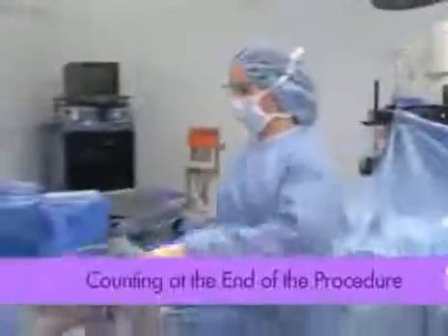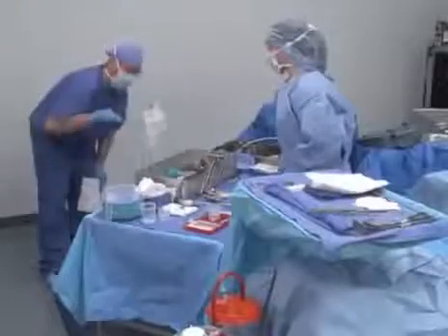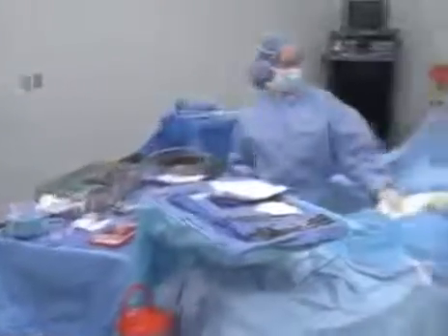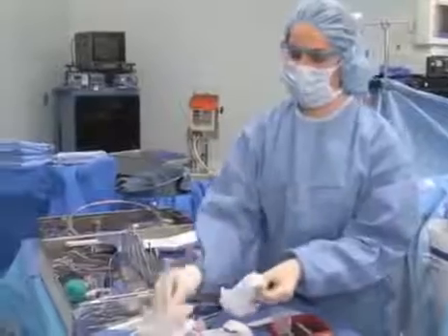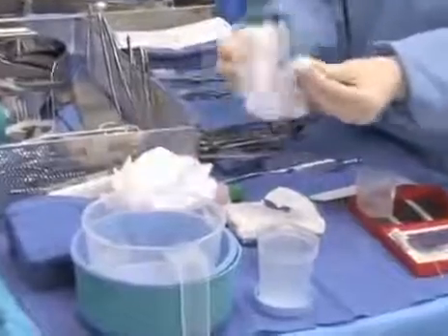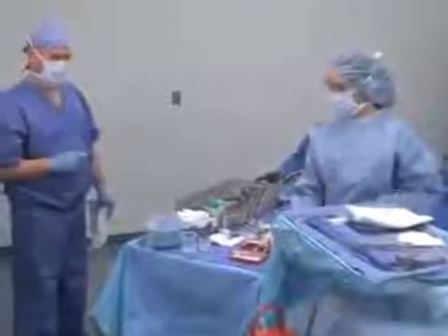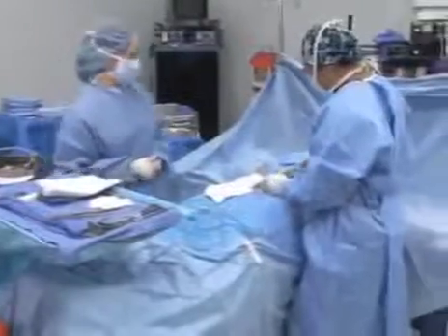Would you like to do a count? Lap sponges: 1, 2, 3, 4, 5. Rays: 1, 2, 3, 4, 5, 6, 7, 8, 9, 10. Needles: 1, 2, 3, 4, 5. And blades: 1, 2, 3, 4. Your count is correct. Thank you.